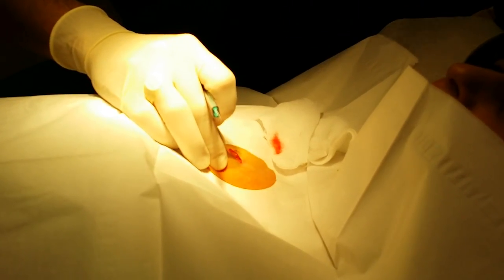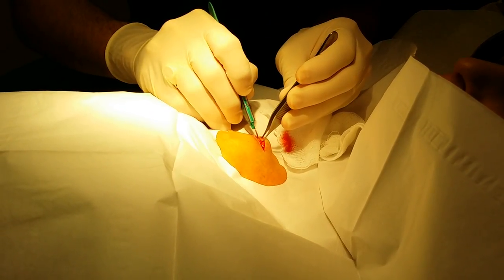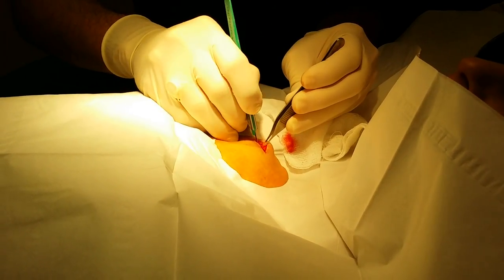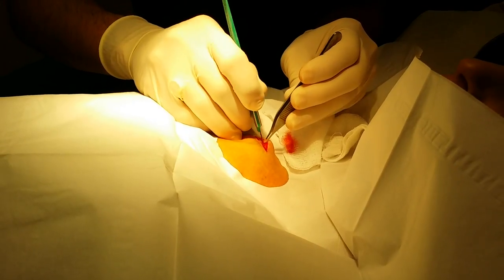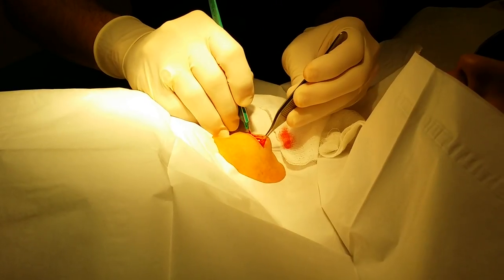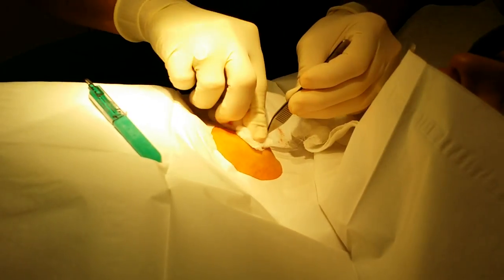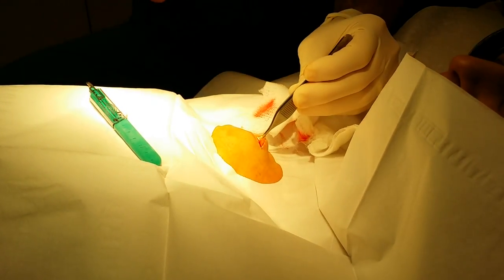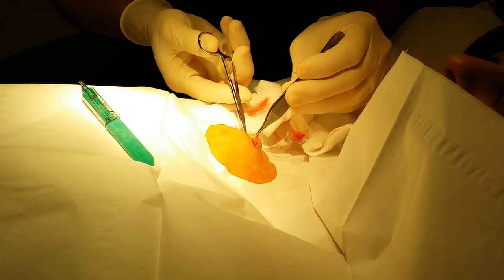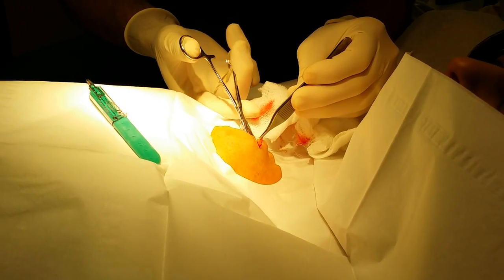I can feel down there where the tubing is, so I'm going to pull up where that tube is and kind of cut around it. The body doesn't like this tubing — it kind of walls it off, so it gets a little capsule around it. You have to cut enough to free it up, and you can kind of start to see the tubing right below us.